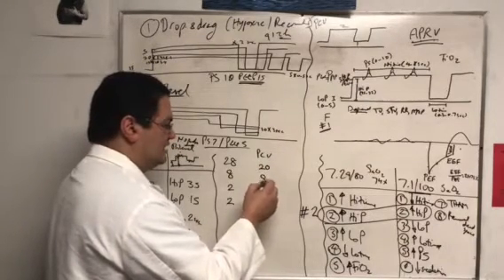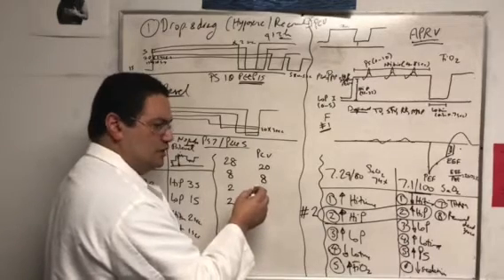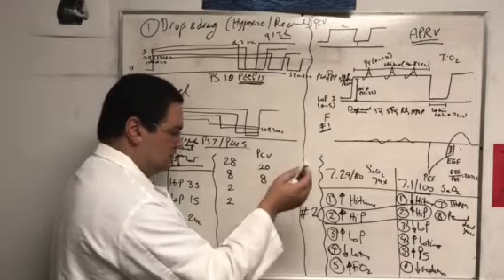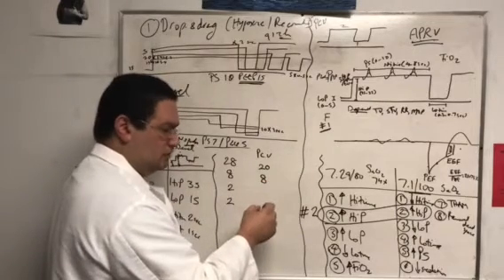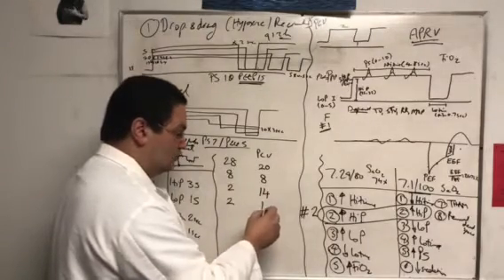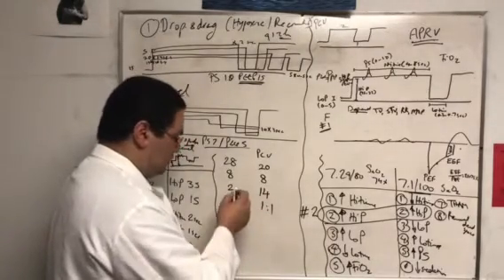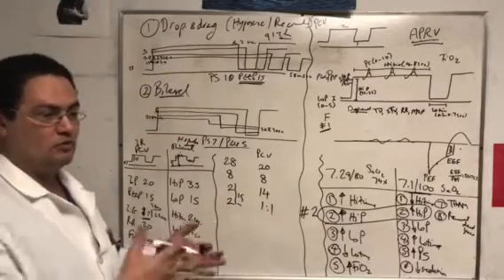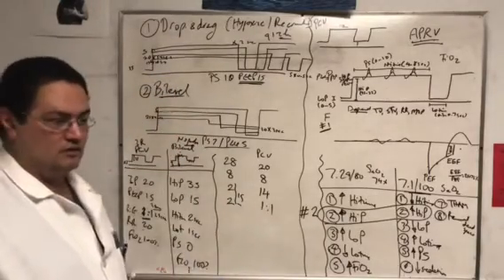And for like 16 years, I've never put anybody on PEEP less than 8, because PEEP decreases the incidence of VAP, unless obviously there's pneumothorax or something, but in general, I never go less than 8. And the rate usually is 14, and it's 1-to-1 I to E ratio. This is 1-to-1 I to E ratio, and the rate is 15, so it's the same thing. So we didn't change anything from what we were starting people on.